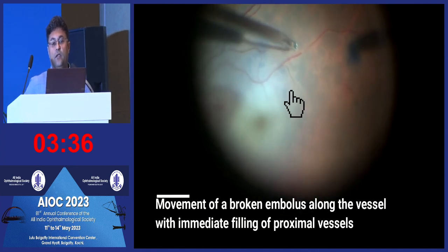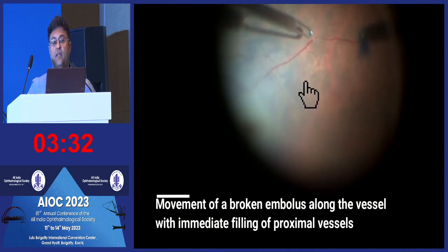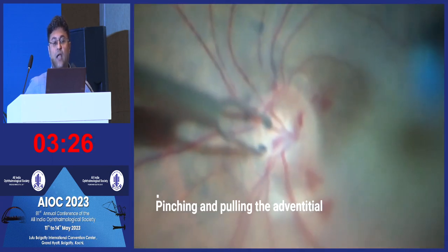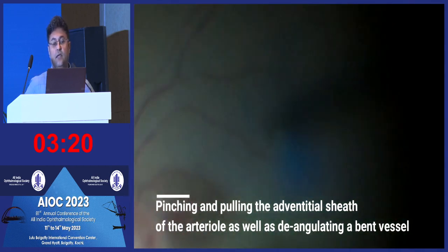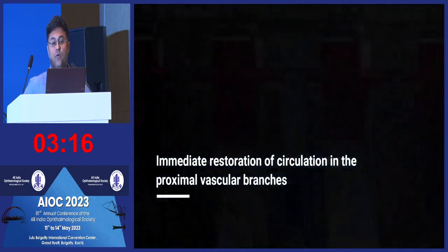So you see here, you see this vessel over here, you see it getting perfused the moment the embolus passes it, till it reaches where it can't really go beyond. I'm just going to rewind it and show you in high mag again. So we nudge the artery or straighten it, so to say, and the embolus then travels. It is actually like, you know, just water being let go through a dam.